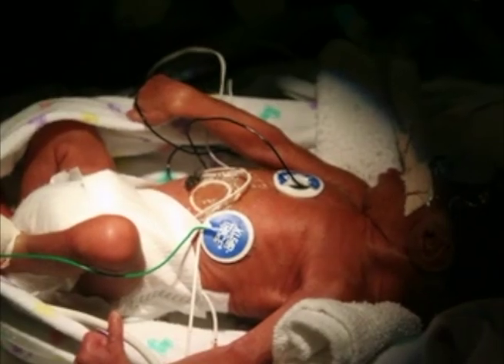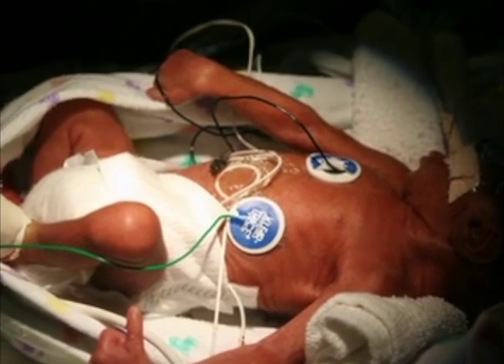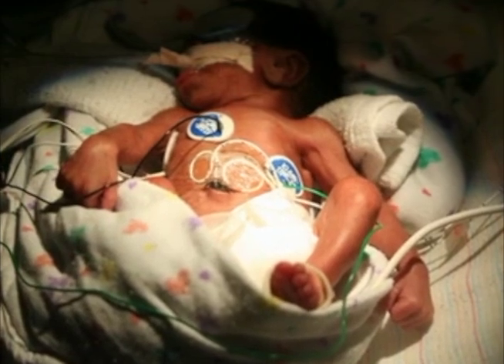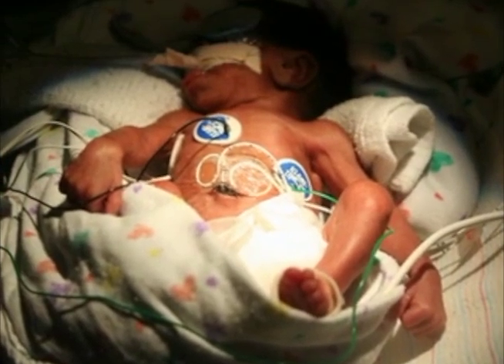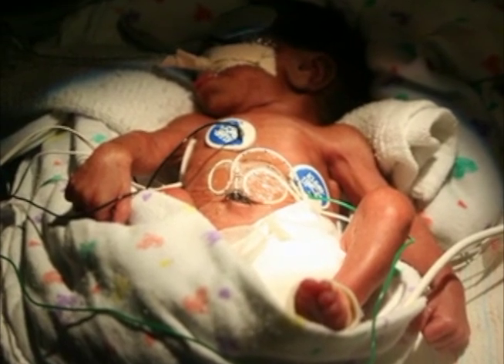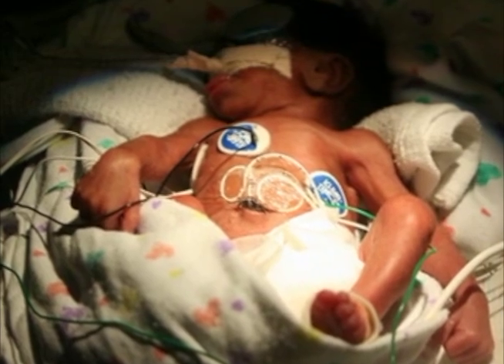The placement of umbilical catheters is an essential technique for the treatment of many newborns in unstable condition. This video will demonstrate the placement of catheters in the umbilical vein and the umbilical artery. Careful preparation, sterile technique, and attention to detail are instrumental in successful catheter placement.